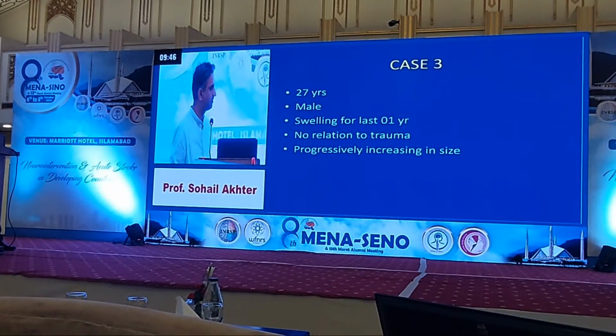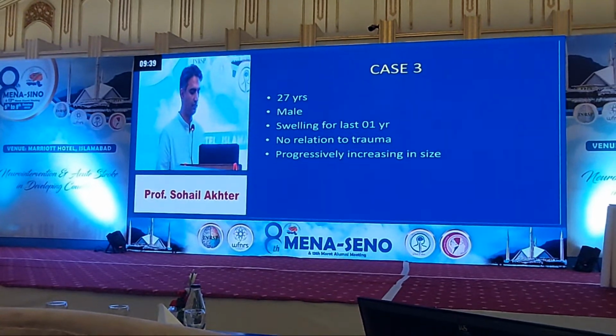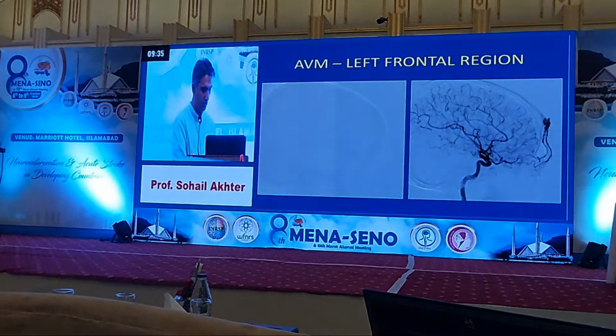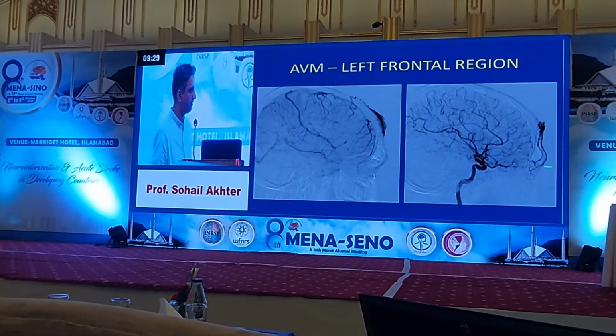The next case is a 27-year-old male patient presented with swelling for the last 1 year. There is no relation to trauma and it is progressively increasing in size. His DSA revealed a small AVM in the left frontal region, which is again supplied by the ophthalmic feeders.